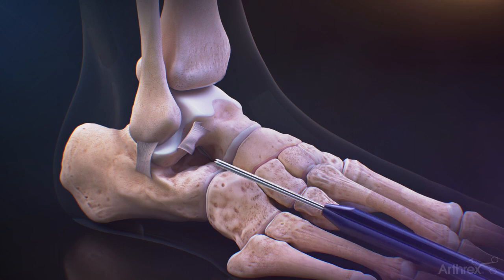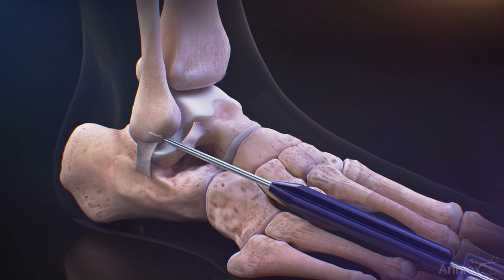Place the slotted guide on the bone and drill using the 1.8 mm K wire drill and cycle the drill. Keeping the guide in place and stable, insert the DX Knotless fiber tack with gentle mallets until the inserter is flush with the guide. Undo the rubber O-ring and remove the suture and needles from the inserter handle, then remove the inserter and guide.